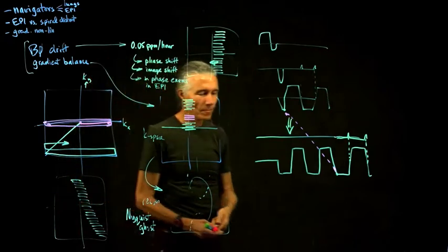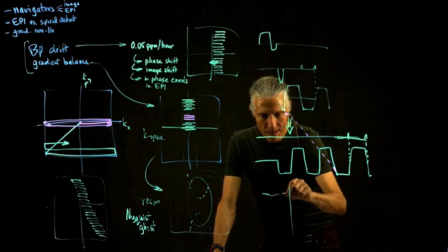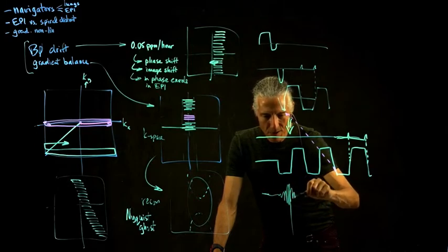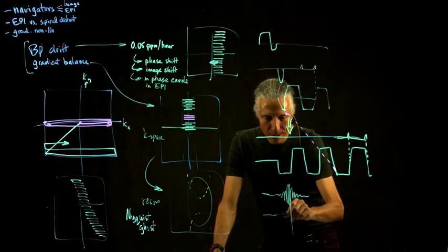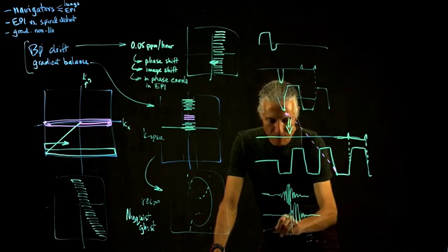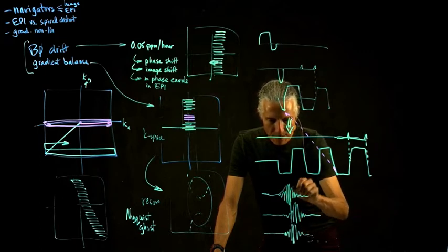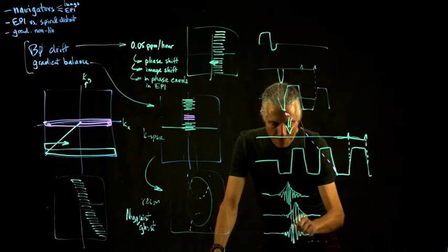You'll get a big echo going across k-space one way, then a big echo that might be slightly offset going across k-space the other way, and then a big echo going back the same way as the first. The peaks of these will be slightly off.